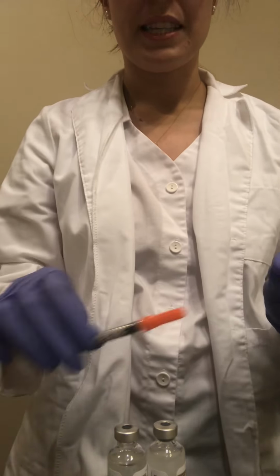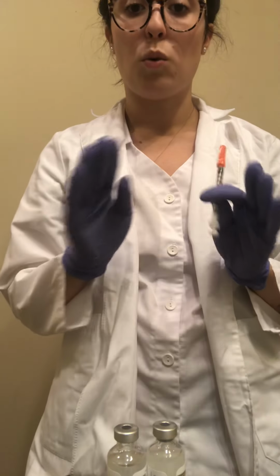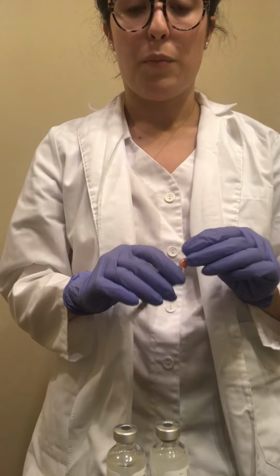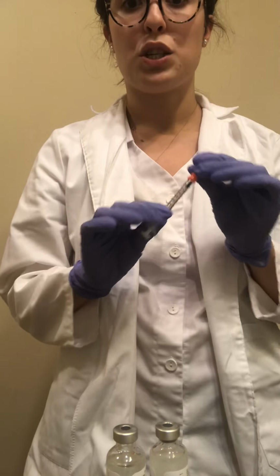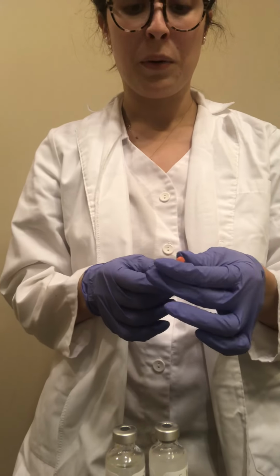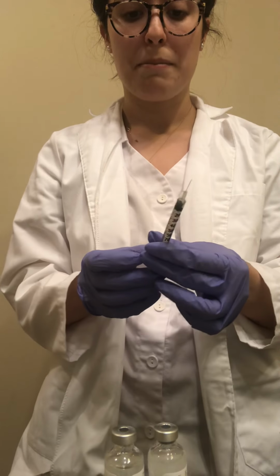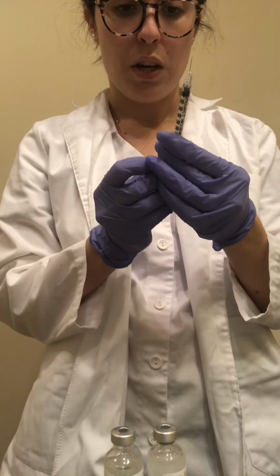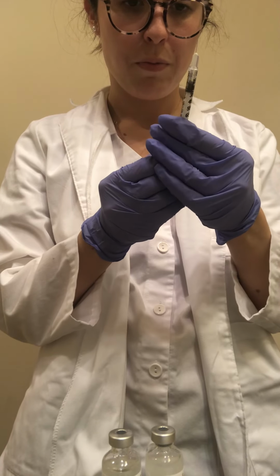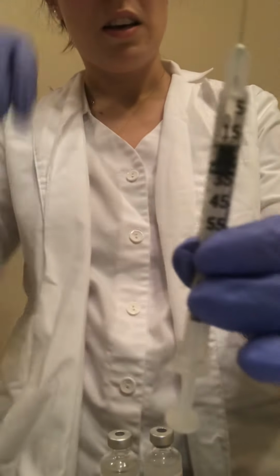All right, and so the next thing we're going to do, like I said, we're going to get 20 units of insulin from each bottle. However, there is an order to do it because of the cloudiness of each liquid. We want to make sure that we know exactly how much insulin of each type that we're going to be putting in here. So, first things first, we are going to uncap the needle. All right, so the needle is uncapped, and what I'm going to do is I'm going to pull back 20 units of air. As you can see here, I know it's kind of difficult.